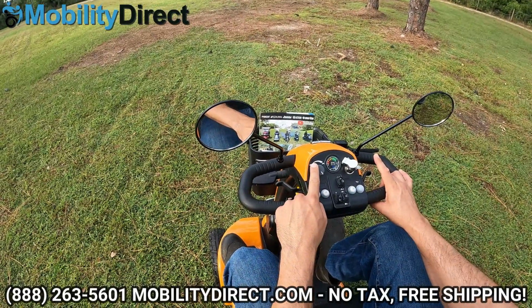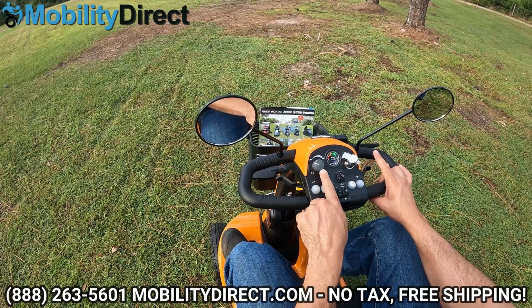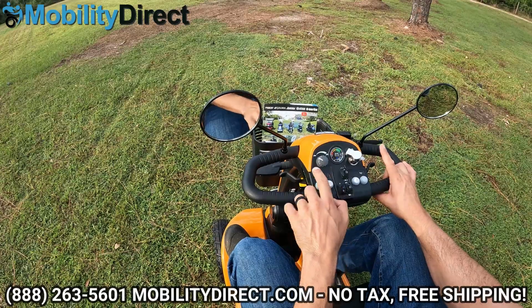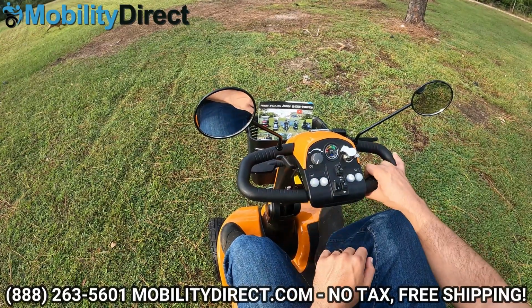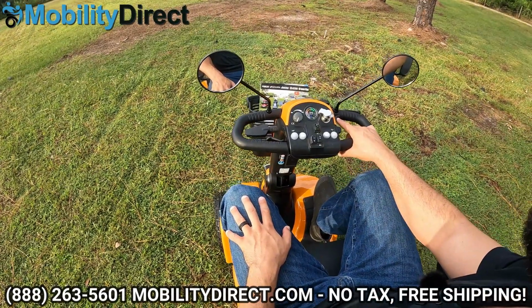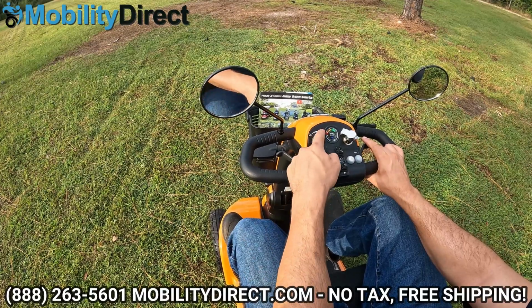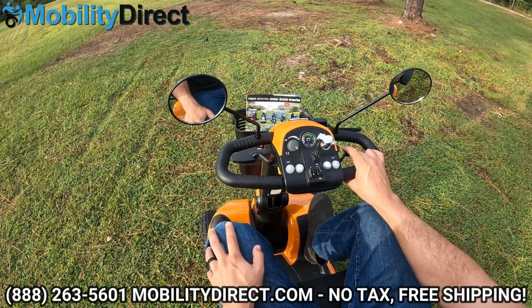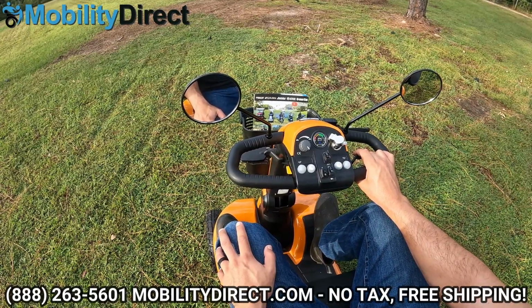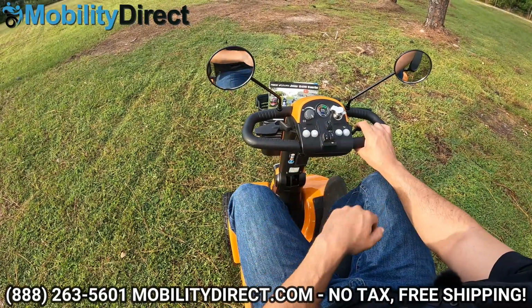Now I've got the speed control knob all the way to the hare or the rabbit, so it's full speed right now, 9.3 miles per hour. I'm going to put it about a quarter of the way. That's going to limit your top speed. So if you put it all the way down and you hit it full send on the throttle, it's only going to crawl at a turtle or tortoise's pace. What's nice though is that if you gently pull, even if you're at full speed, it's not going to take off right away. It's going to travel very slow because it's responsive to the touch of the throttle. So I can get it to go very slow even on full speed.